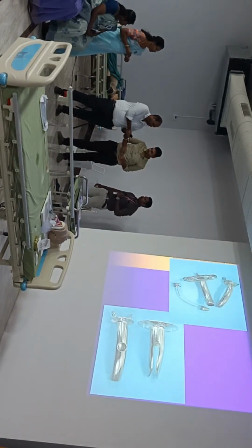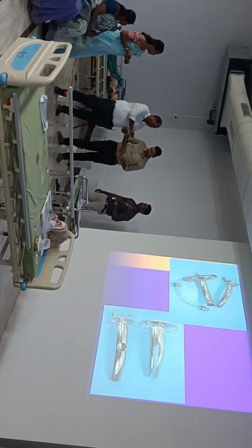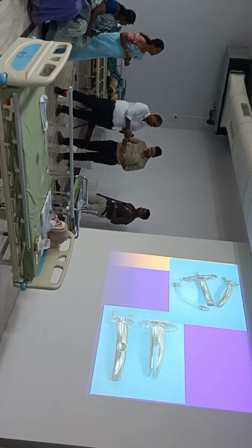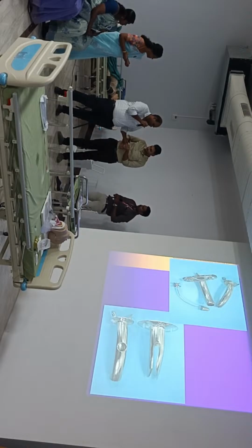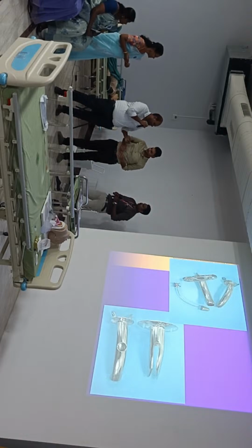Turn it clockwise or anti-clockwise. You need to turn it 180 degrees. Remove the tube. What does this number indicate? Yeah, size of the tube. This 26, what? 26 inches, 26 kilometers, 26 meters? 26 French gauge. These are French made tubes.